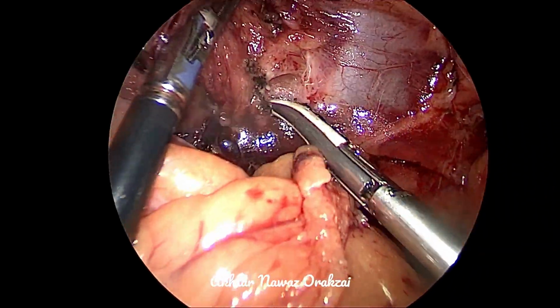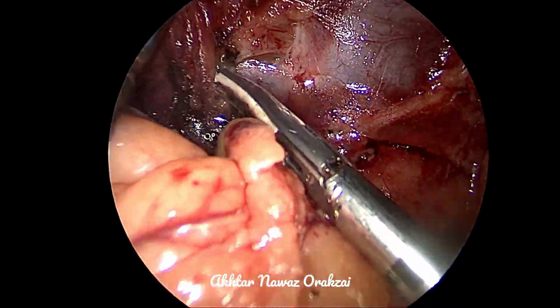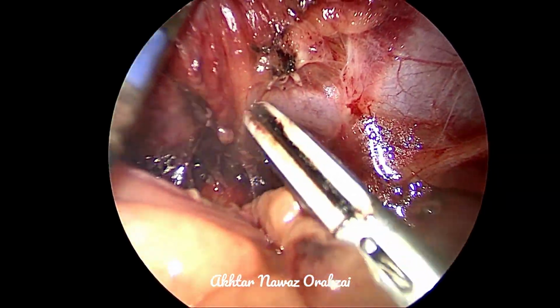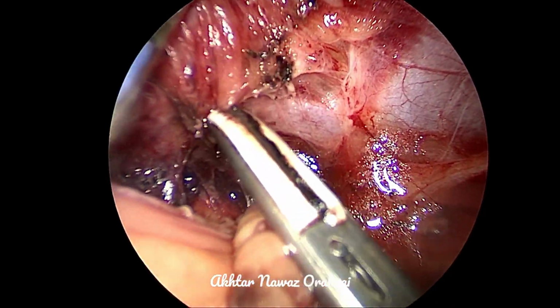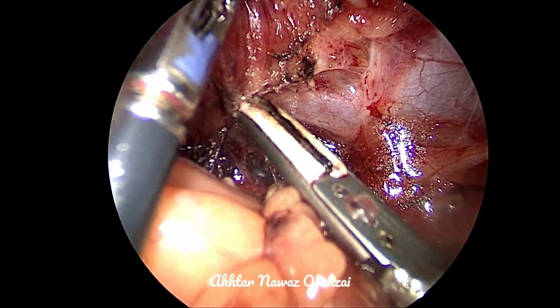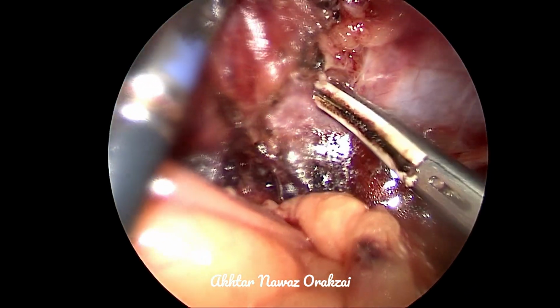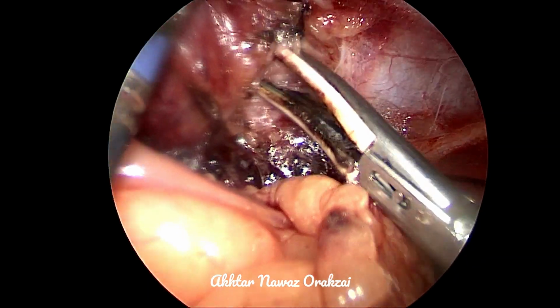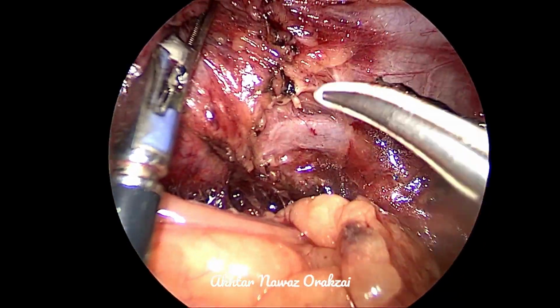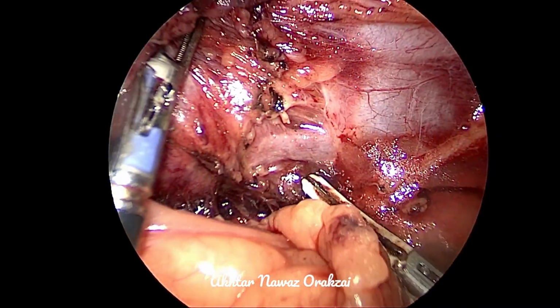Here you can see the adrenal vein is visible now, and we are trying to dissect it enough so that one clip can be applied. And once the clip is applied, in almost 6 to 8 seconds, the patient usually becomes hypotensive, because of the loss of the tone in the vessels, especially in the vein in the intravascular compartment.